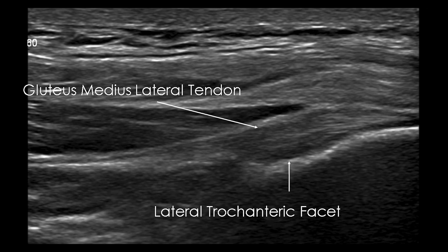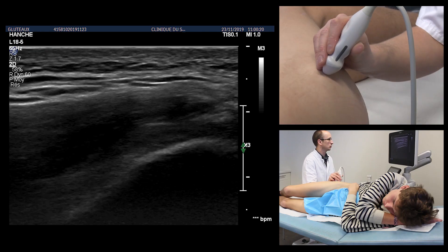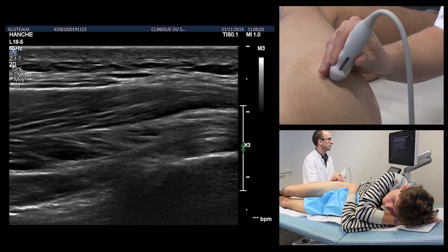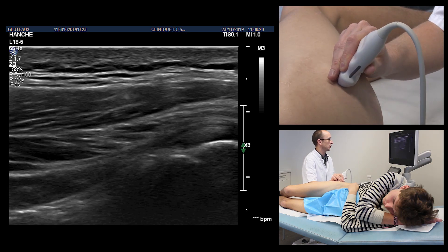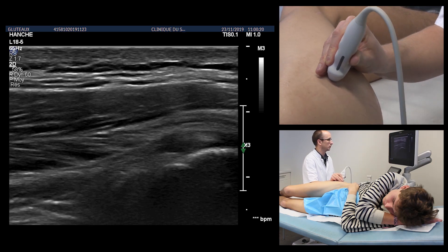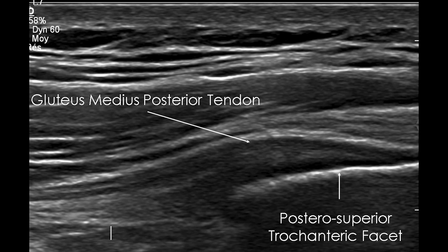On the lateral trochanteric facet is inserted the anterior tendon lamina of the gluteus medius. A vertical 90-degree rotation of the probe will allow the tendon to be viewed over its entire height and enthesis. On the posterior superior trochanteric facet of the greater trochanter is inserted the main posterior tendon of the gluteus medius.